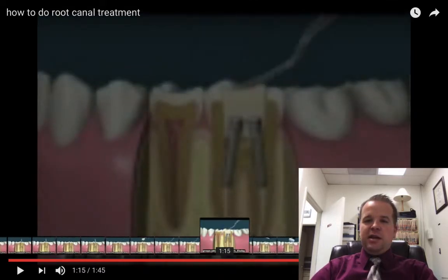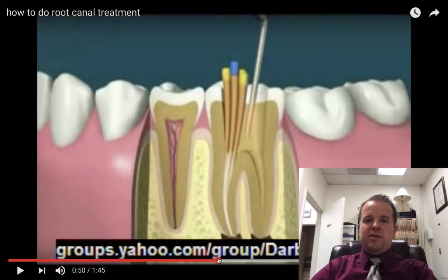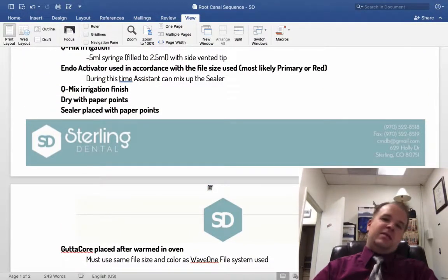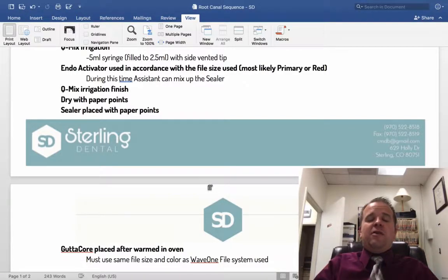As we come down here to the end, well, let's go here. This is kind of what the gutta percha looks like. You'll use these files that go all the way down there, and it's an orange filling material that you'll use, and you'll be using it to warm up in the oven. So you use the same size of gutta percha as you do the wave 1 file, and then that will be all cleared out. Once that's done, you'll put a filling in the top of it, and then you'll be off to the races. So then you'll follow the sequence of what it's like for a composite filling or an amalgam filling, whatever the dentist feels is the best sequence for that.